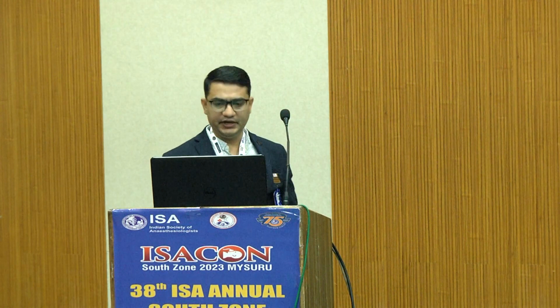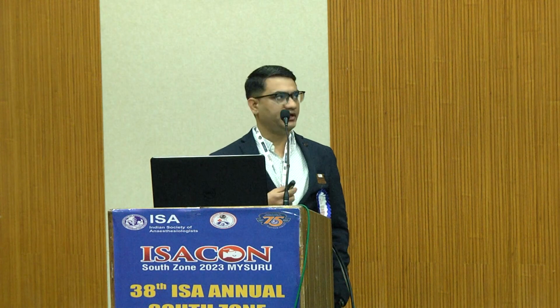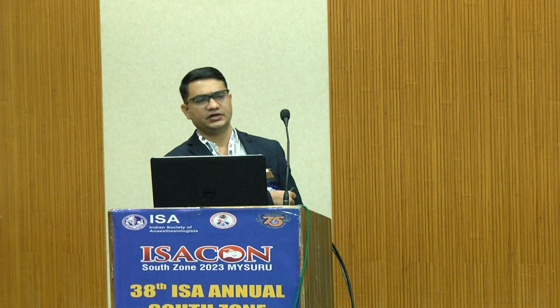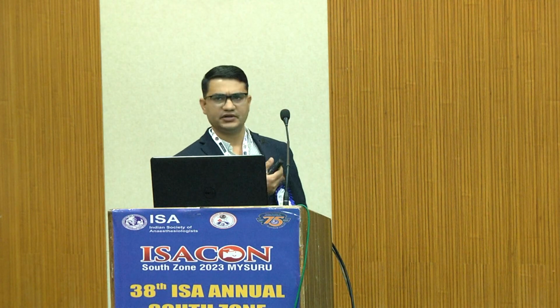The causes of intermittent dropouts, or inability to read the pulse oximetry, is the commonest error we encounter in the ICU or OT. The patient may be hypovolemic, or a sepsis patient with hypovolemia, or have arterial compression, or we have put a sphygmomanometer cuff on the same limb where the pulse oximetry is monitored, or arterial block or peripheral vascular disease. These are common conditions. The most common causes are hypovolemia and hypothermia. These are some of the conditions which attenuate the signal.